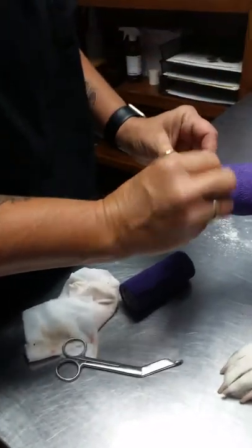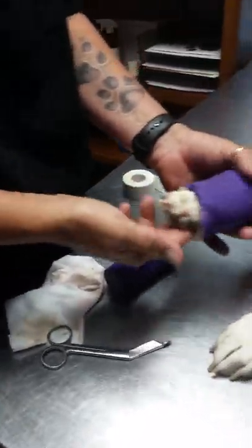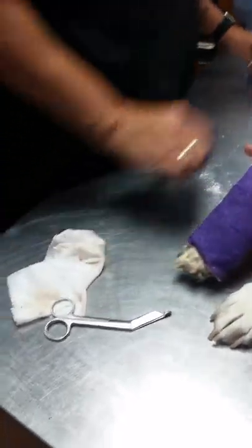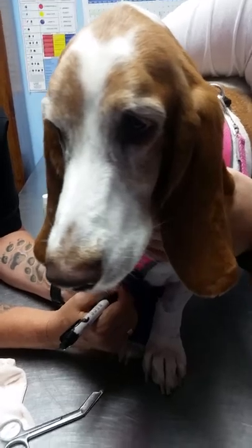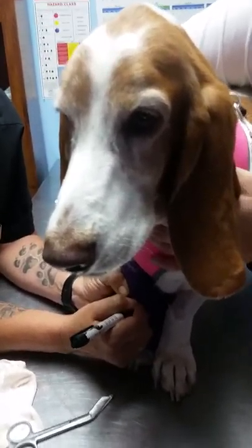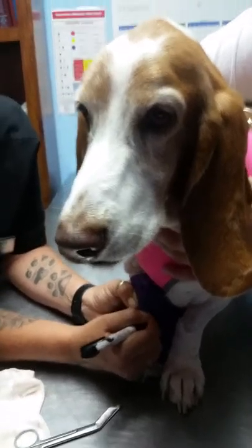Always run your finger around here just to make sure it's nice and smooth underneath and she doesn't have too much cord. There you go, you're pretty! Don't jump, suicide Sally, don't do that. Date it so you can remember what date you put it on.